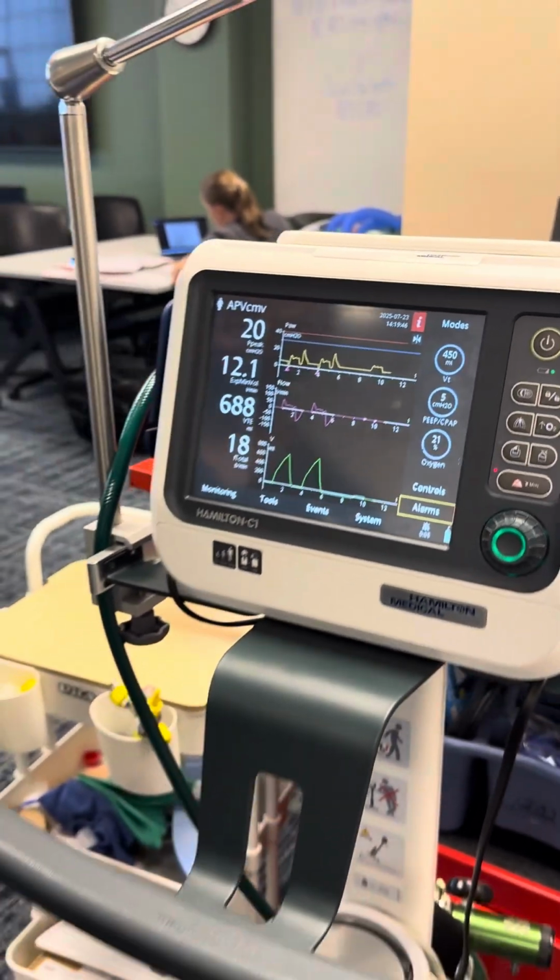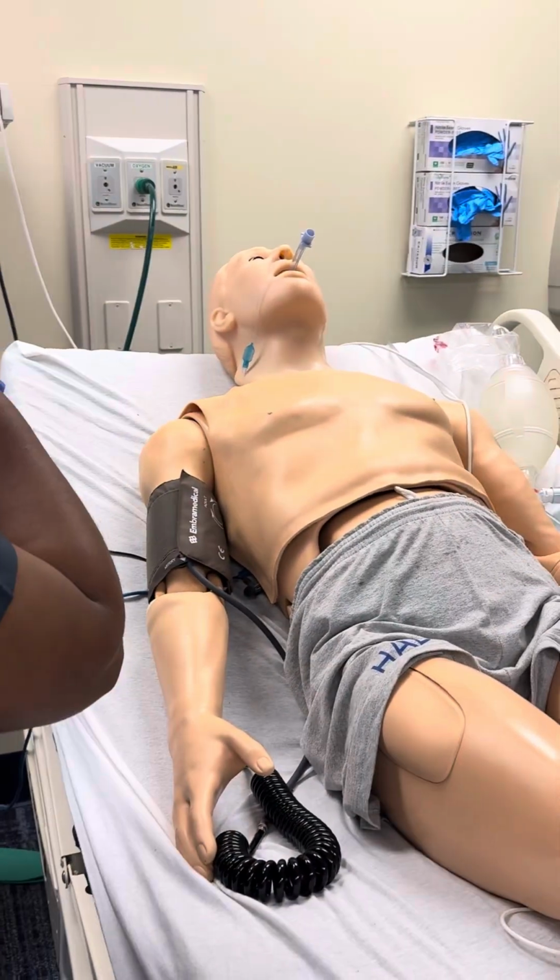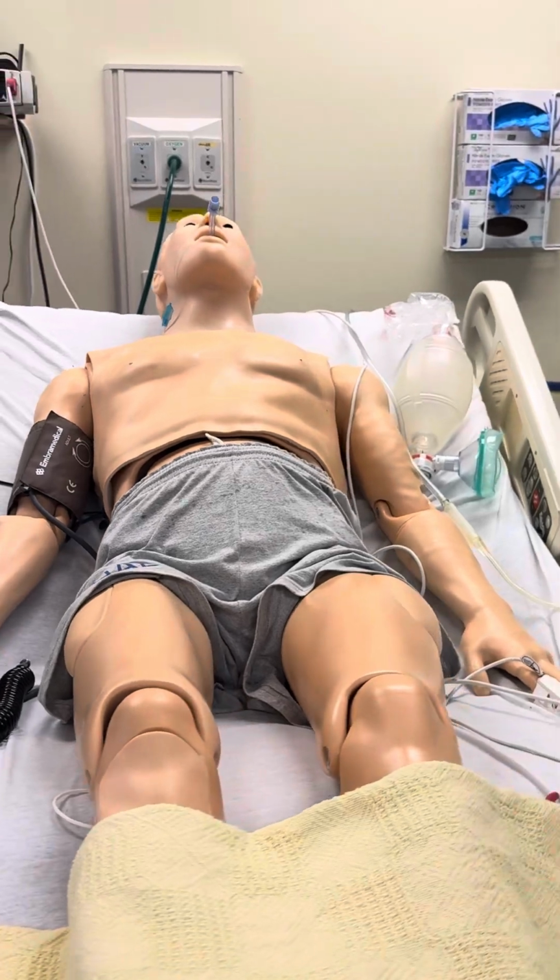And now I'm going to check on the patient. I'm going to listen to breath sounds in 6 different places.